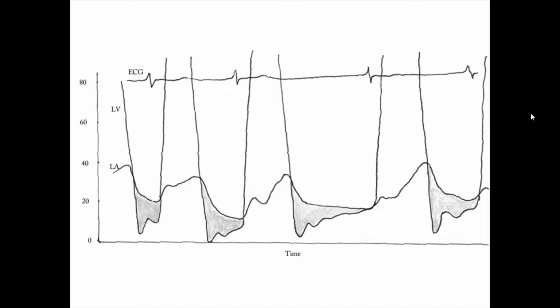What about the V wave? We usually look at the descending limb of the LV. We have a V wave around 30, 30 to 40. So high V wave. This indicates a diagnosis of significant mitral regurgitation, MR. So this patient is having atrial fibrillation, MS, MR. Now you see how easy you can get the diagnosis if you systematically interpret the findings you have.